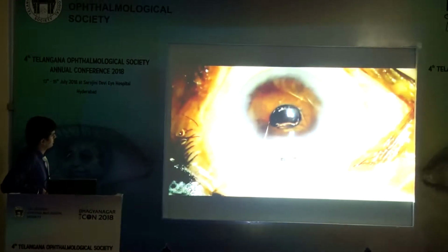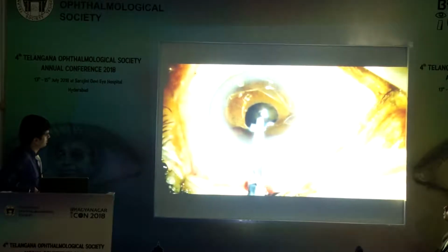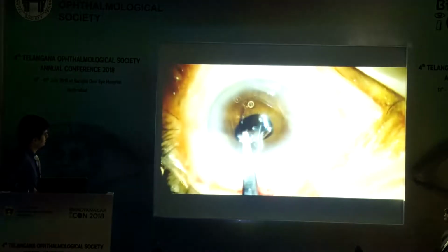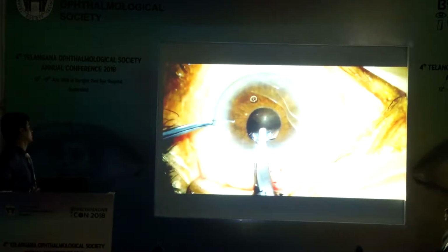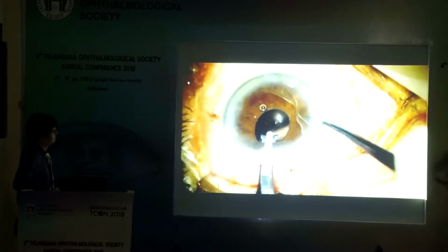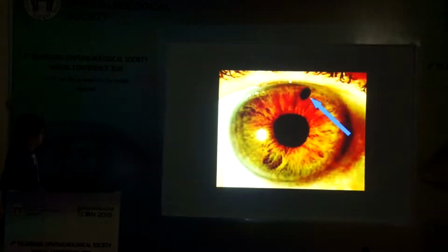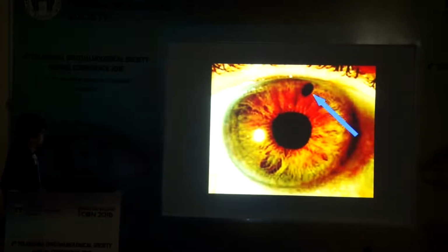The IOL is inserted in the eye over the iris and rotated. The optic is then held with a forceps and positioned centrally behind the iris. The iris tissue is enclaved between the IOL claw haptics using special enclavation needles or a dialer. A superior peripheral iridectomy is usually performed to prevent pupillary block glaucoma.